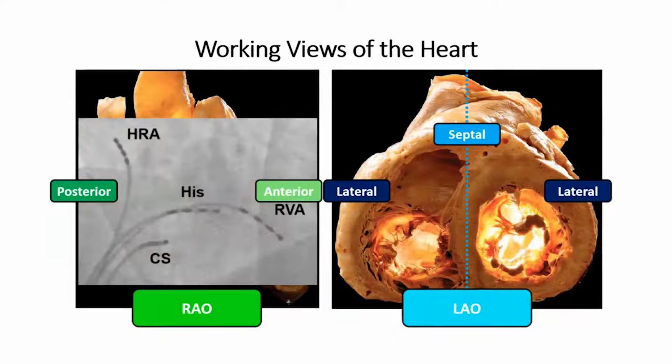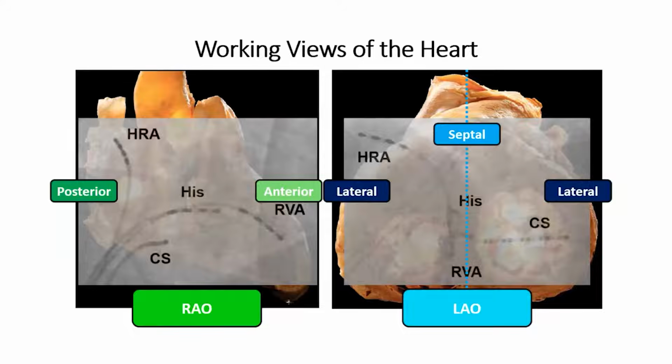When we take our catheter position for a general EP study, we can see how they sit in the RAO view, and here we can see how they're inset in our LAO view. Notice here in the LAO view how the HIS catheter and the RV apical catheter stay on the RV side of the interventricular septum. And notice how the coronary sinus clearly breaks through the septal demarcation and is measuring the left atrium, passing through the area of the interatrial septum via the coronary sinus.